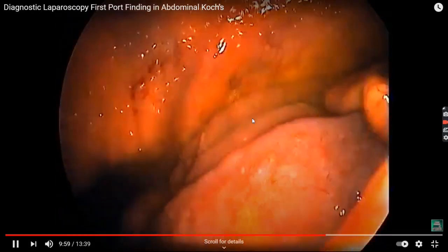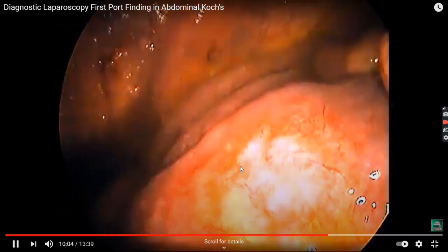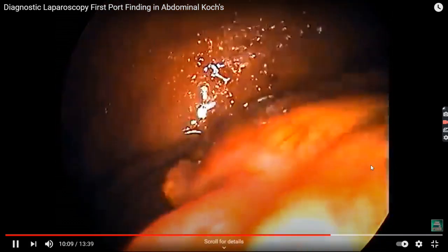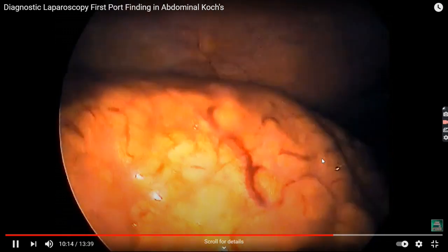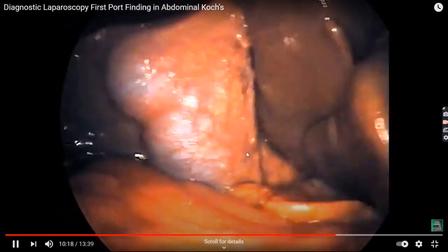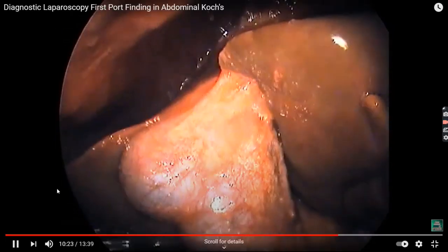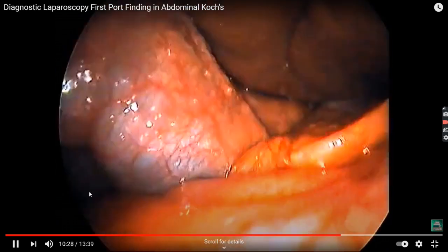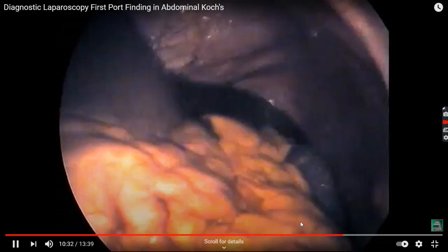So after sucking out the ascitic fluid here, now you can see the lesions over the small intestine loops, the greater omentum, just like a cake-like, pancake-like appearance. Cake-like pattern is there, thickened omentum. Gallbladder with meso gallbladder, vein studded with tubercles, and again you see the ascitic fluid that is present just on the right side of the gallbladder.